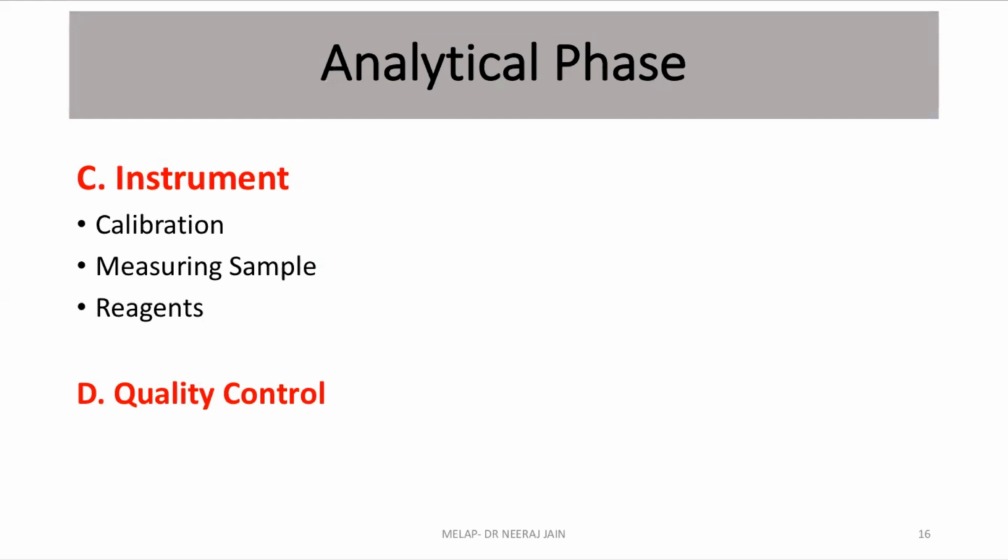Sometimes the clinicians want to know about the methodology to be used. They want to discuss methodology. They may say, we want reticulocyte count by a particular method, by automated method only. We are providing the patient chemotherapy and we want to know the reticulocyte count over time.